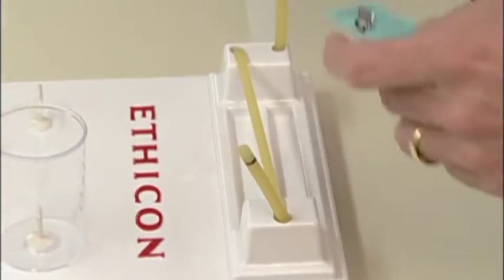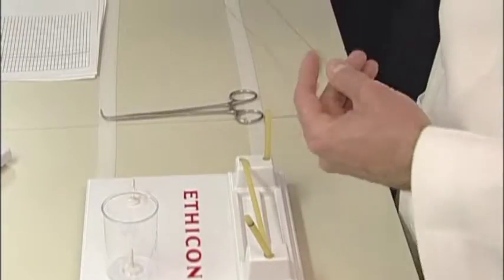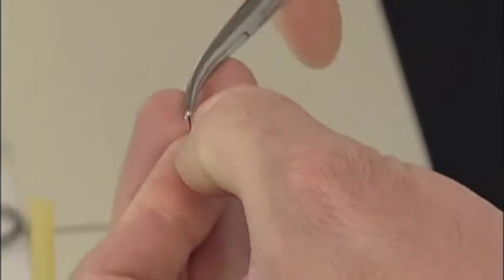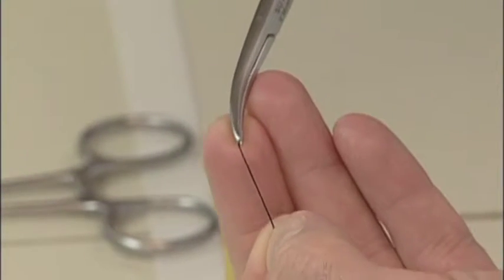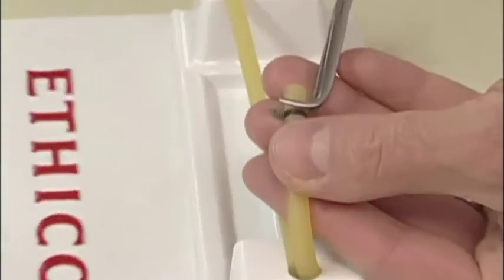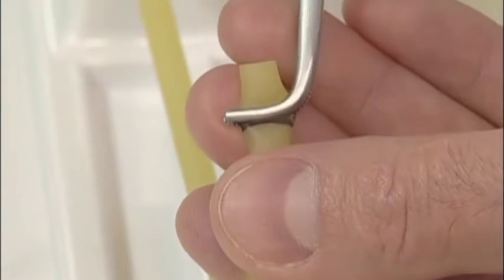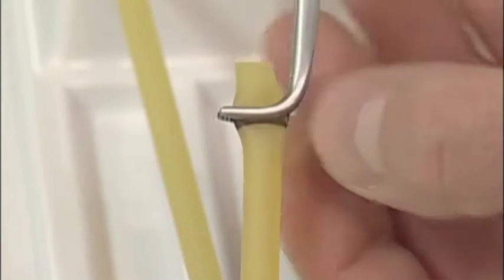So the first step will be to use a 2/0 silk tie, and we'll load the end of this tie on a hemostat as shown here. Ideally you want that coming straight off of the end of the clamp so that it's easy to pass. We'll have that ready, and then we'll use this right angle clamp to actually clamp across the black segment, the target line, and we'll leave about 1 millimeter of target line exposed as shown here.